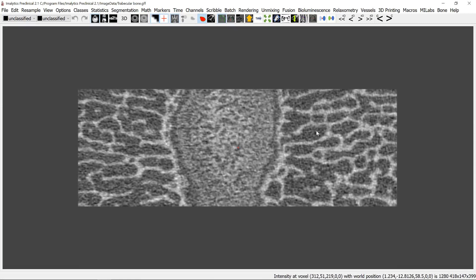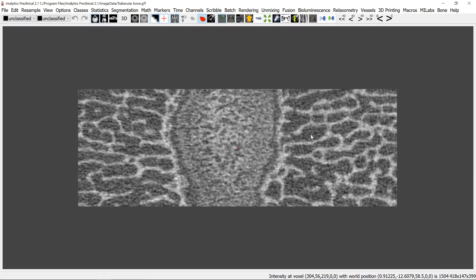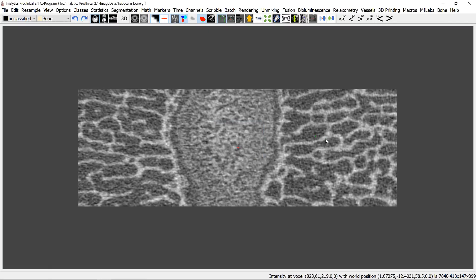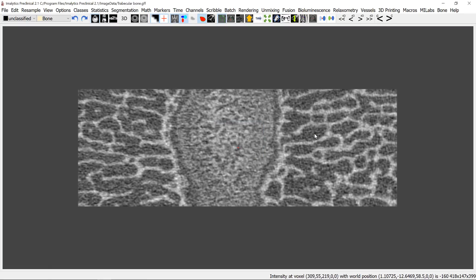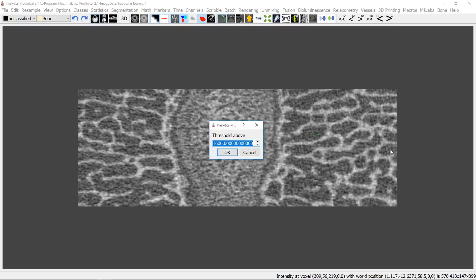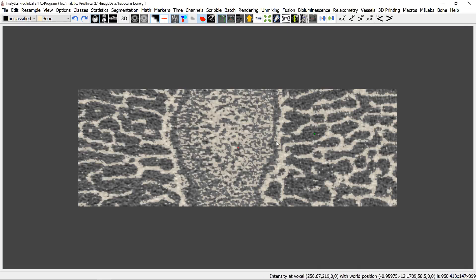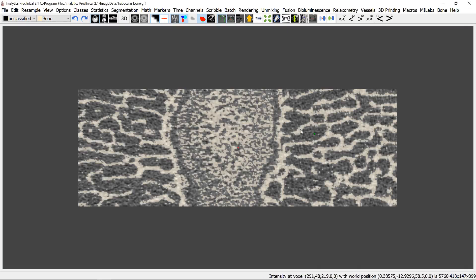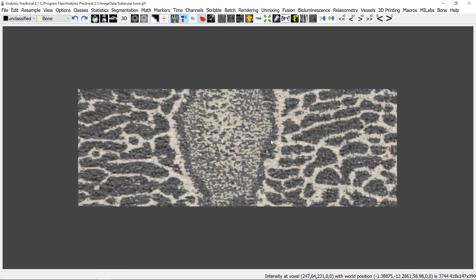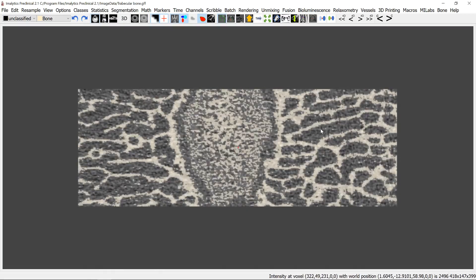So let's pick a threshold to segment the bone parts, add a class bone for example and pick some threshold between the bright intensity and the dark intensity, something like above four thousand. And now you can see the bright voxels were segmented as bone only and you can see that it's a bit too noisy actually because there are all these smaller spots.